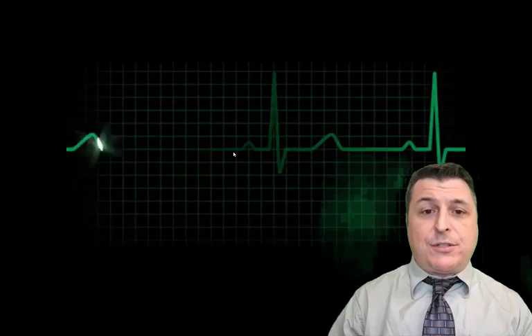In just about every medical drama, you probably have seen a machine which displays this particular waveform on its screen. This is an EKG, or an electrocardiogram. This is a visual representation of the electrical activity that's occurring in the heart. In this video, we're going to talk about the heart's electrical system and how an EKG is used to measure that electrical activity and what we can learn from the results.